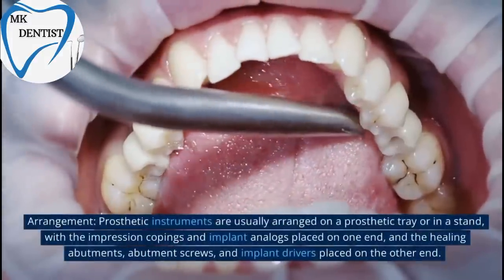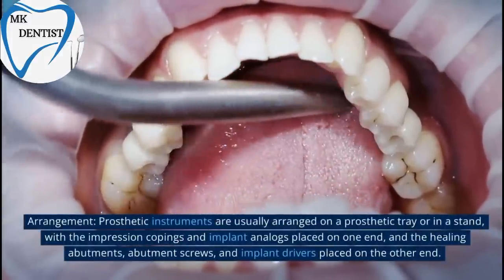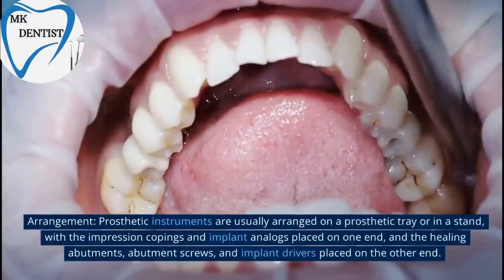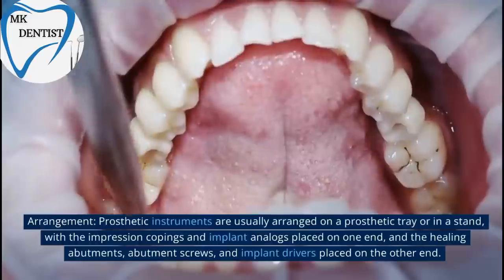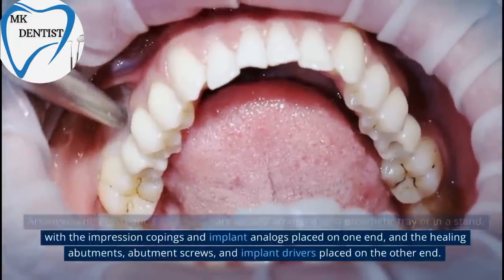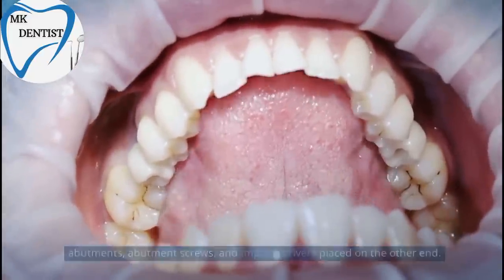Arrangement. Prosthetic Instruments are usually arranged on a prosthetic tray or in a stand, with the impression copings and implant analogs placed on one end, and the healing abutments, abutment screws, and implant drivers placed on the other end.